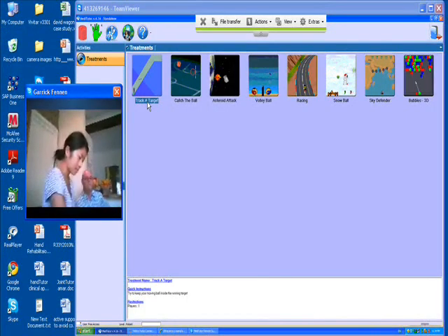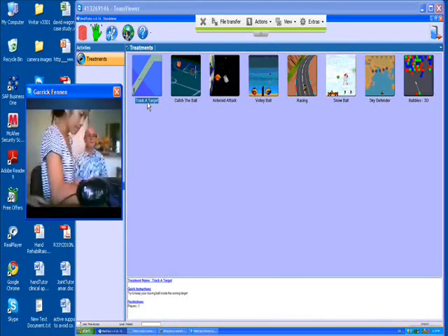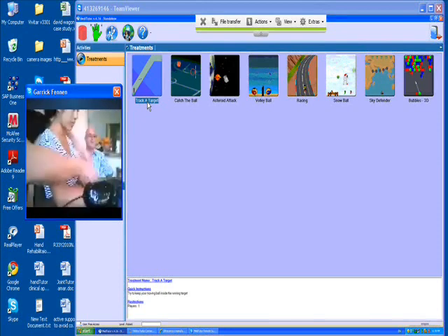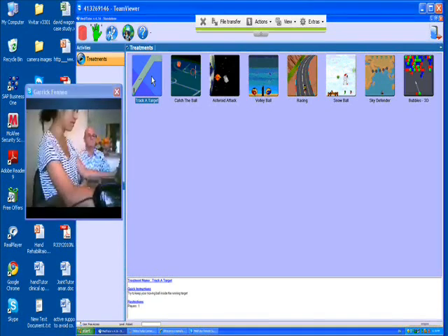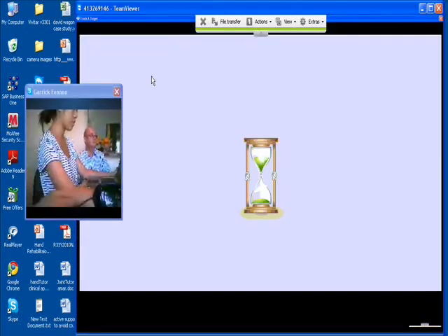Camera down a little bit so I can just see how you're sitting. Excellent, okay, that's good. Okay, what I'm going to do is click on the tracker target — this is the one that you've been practicing.